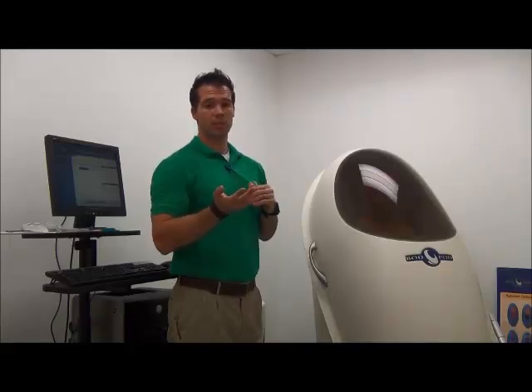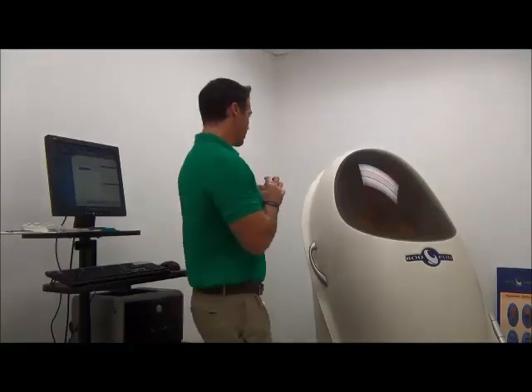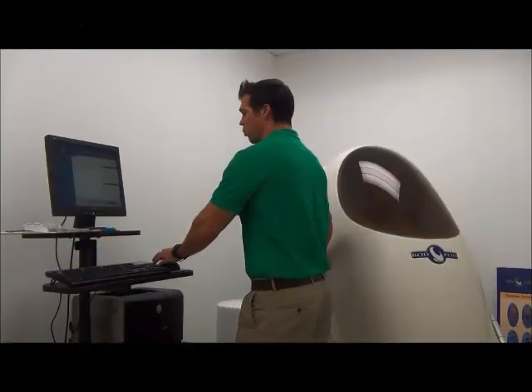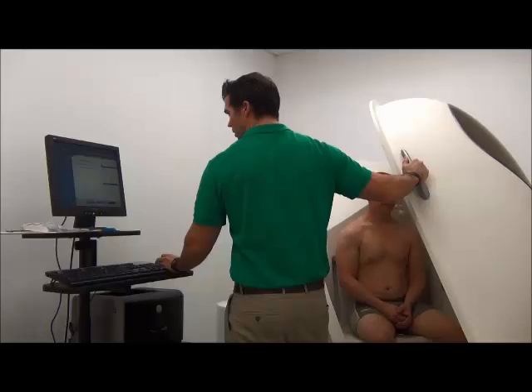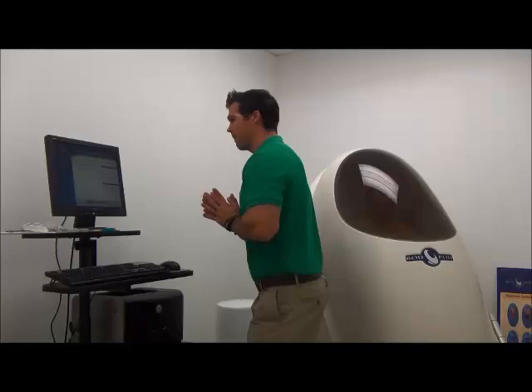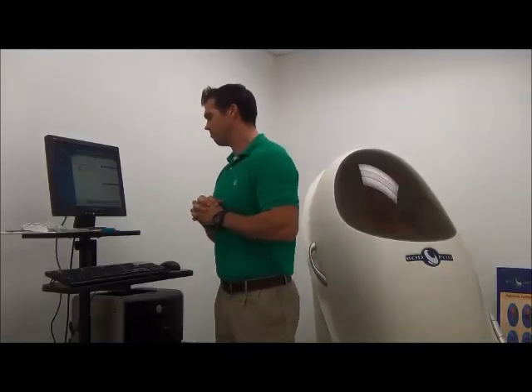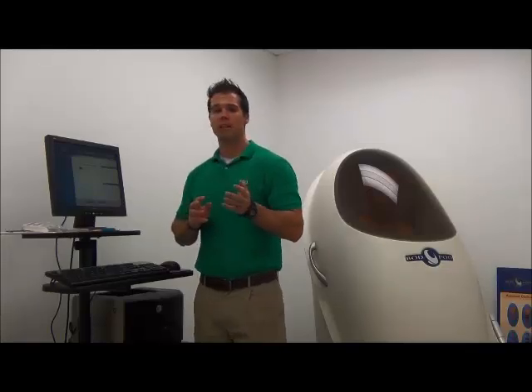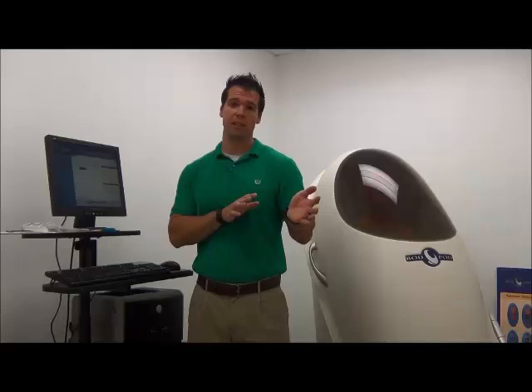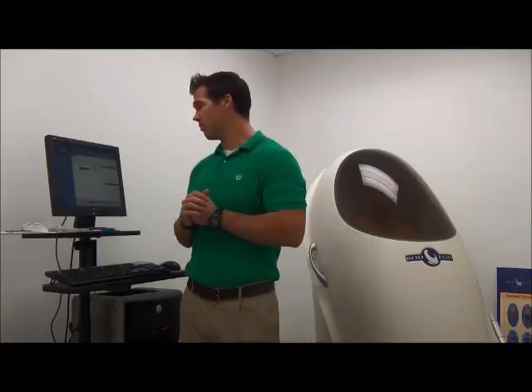This machine requires two assessments to ensure reliability. We ask the subject to be still, then we open the door and do one more measurement to make sure the two results match each other. To prepare your subject for the most accurate measurement, you really want them to be fasted and to have not engaged in any physical activity for at least 24 hours before, as those factors can affect the measurement of body density.